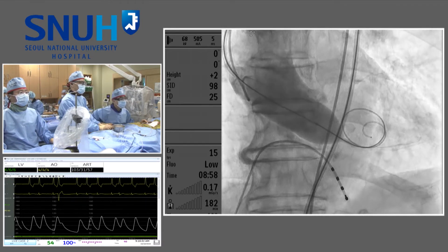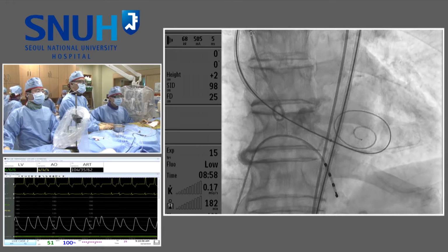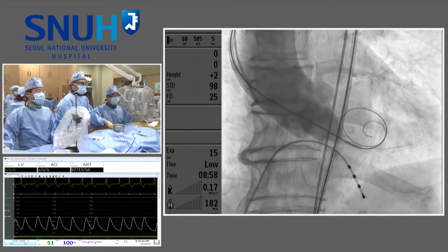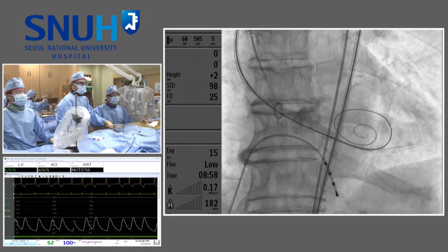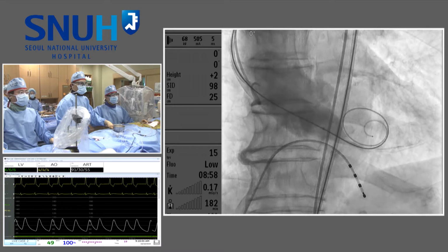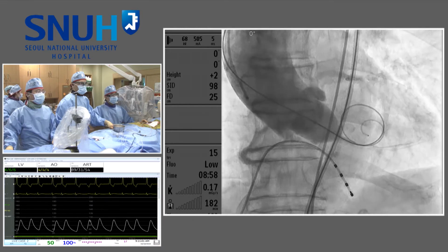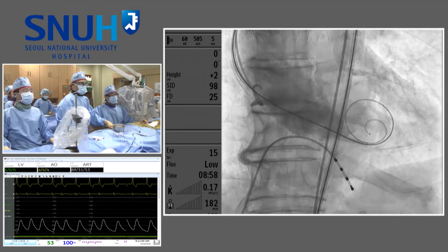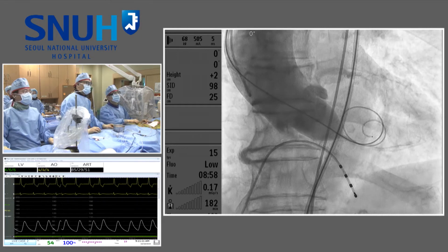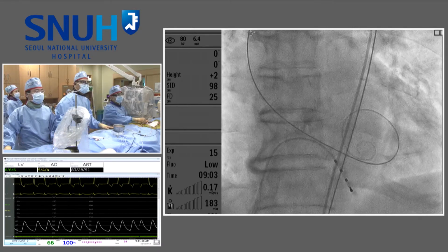How about the movement of calcium chunk? Sinus valve surface space is large enough to accommodate displaced calcium chunk. But in non-coronary side, the sinus of Valsalva is all occupied by displaced calcified leaflet. Yeah, that's what I said before, and I got to admit that, in those cases, despite of what we all talked before, I think that there is advantage for self-expandable retrievable valve. And coronary protection, preemptive coronary protection is pretty necessary in this case.